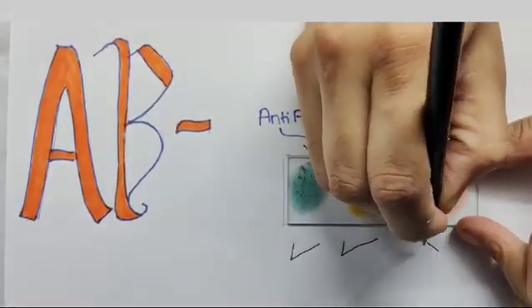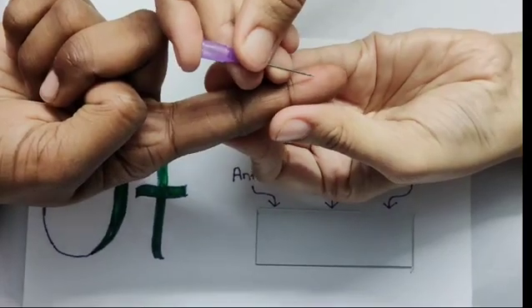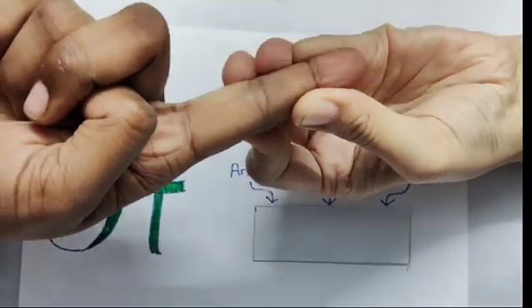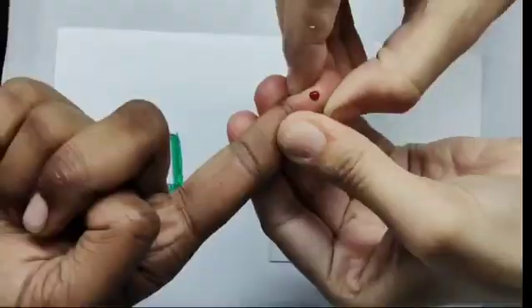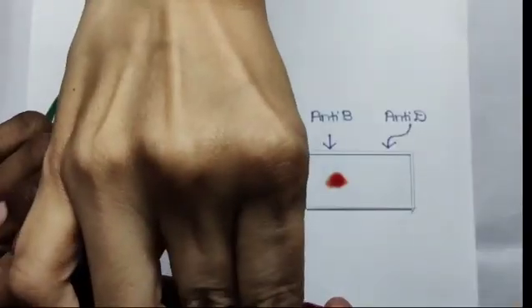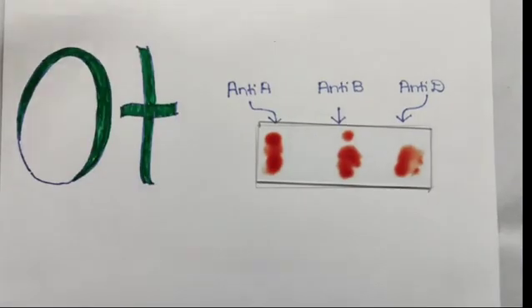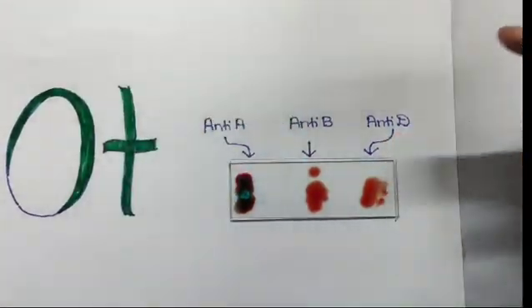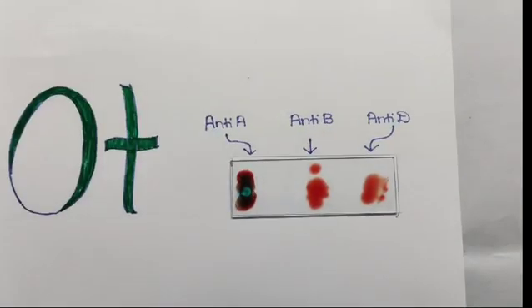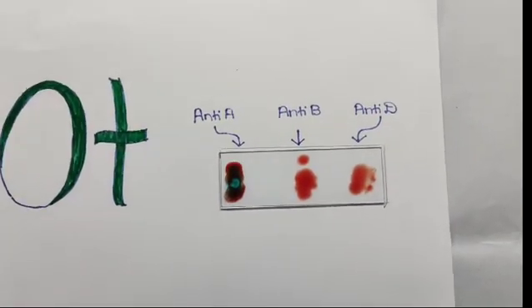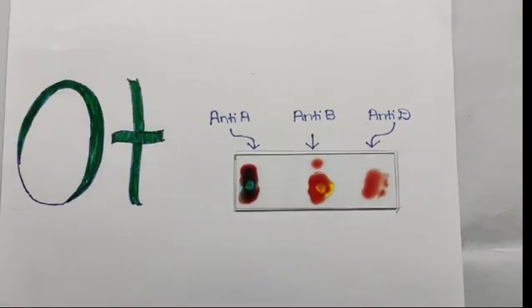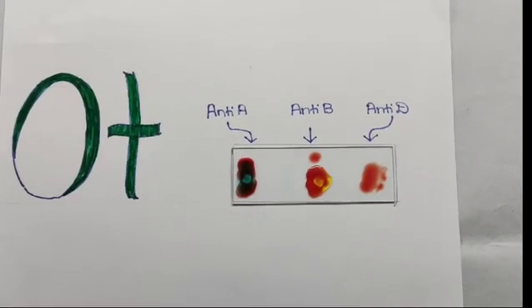Do the same for O positive blood group. Here, no clotting is seen in anti-A and anti-B, which means both antigen A and antigen B are absent. Hence, it is O blood group.